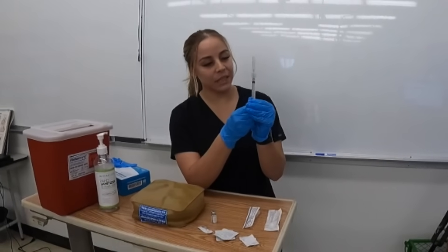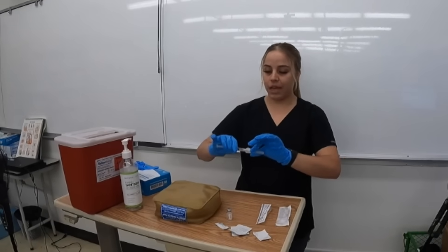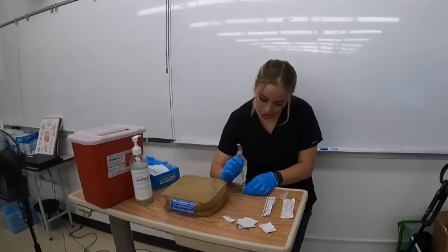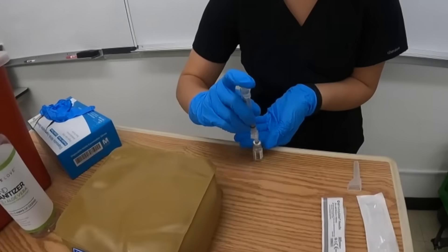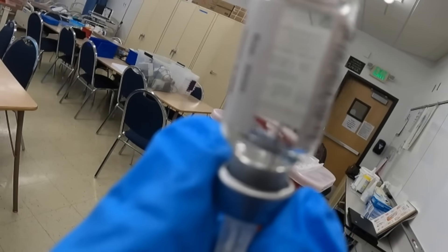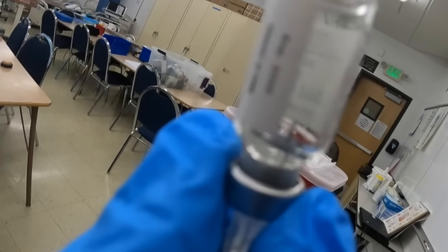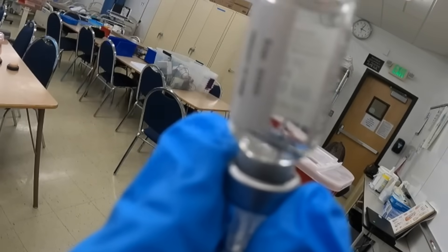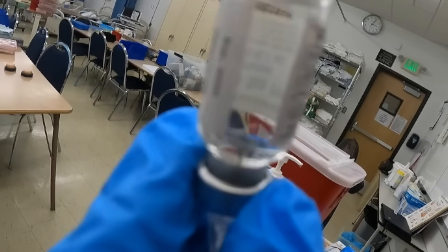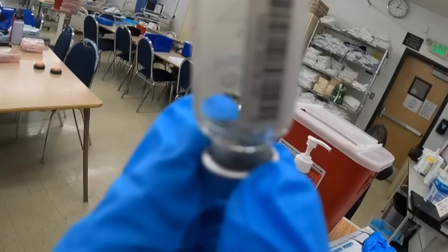Now I'm going to draw one milliliter of air, take the cap off using the horizontal method, and inject the vial with one milliliter of air, then flip it over. In this vial we have one milliliter of liquid, so we are pulling up the full one milliliter. As we get closer to finishing up the medication, the needle can be exposed and we can draw up air, so we want to adjust the needle to make sure we get all the medication without drawing up air.